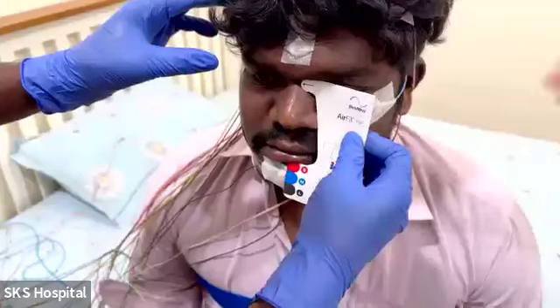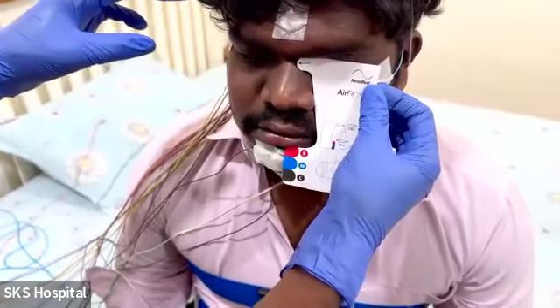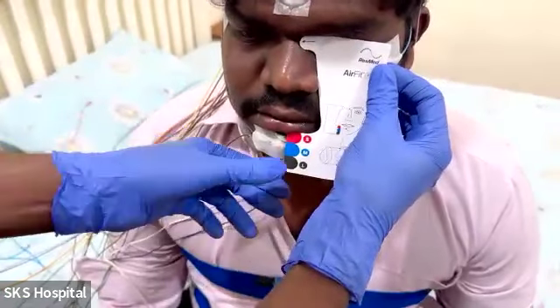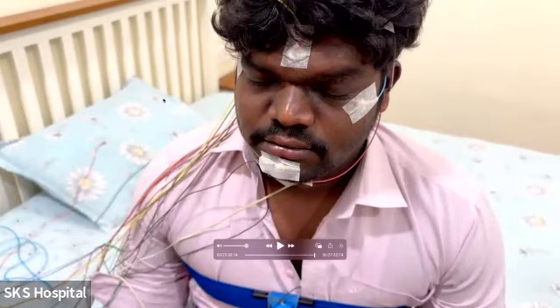This is for the oronasal mask, where small, medium, and large can be seen based on the patient's facial structure. Each mask is tried to fit in. So this is just an overview of how we connect it.